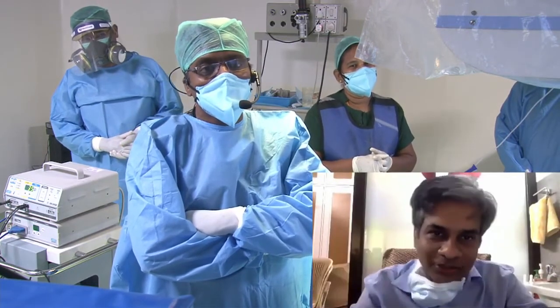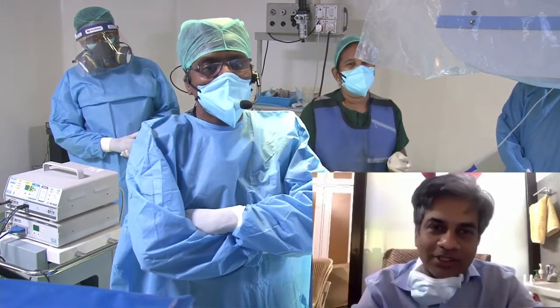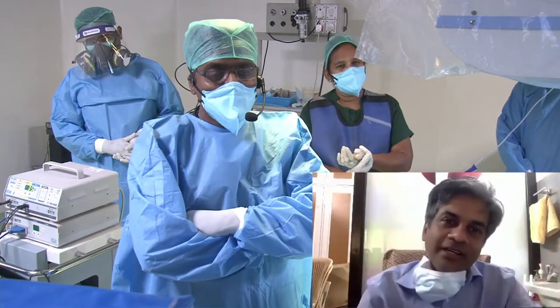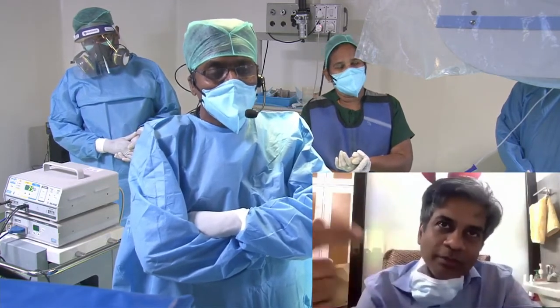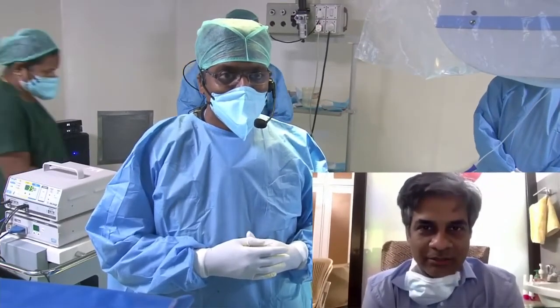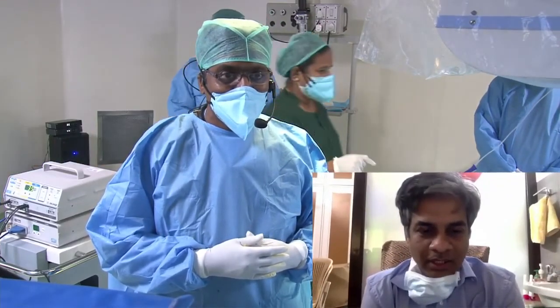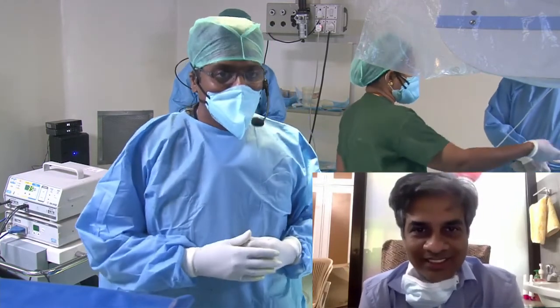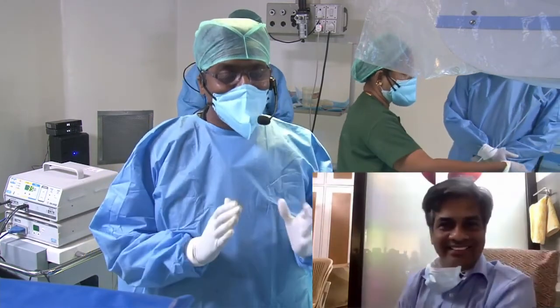You take a small incision on the cystic duct before performing the cholecystectomy, pass in a tube and do a cholangiogram from there, and you already get an idea of what to expect if you have to do an ERCP. Many surgeons will be hopeful that they can start doing this and not lose it to the gastroenterology colleagues. That is really the reason why I'm pushing this.